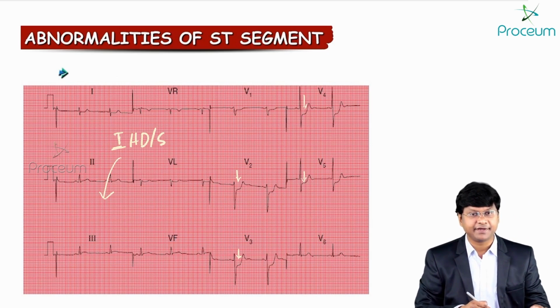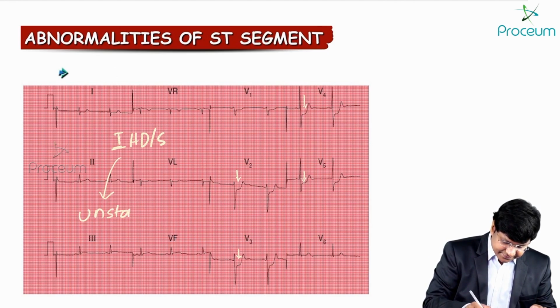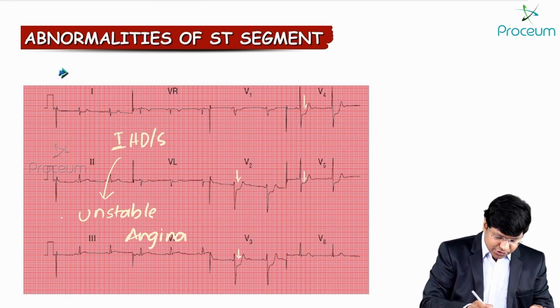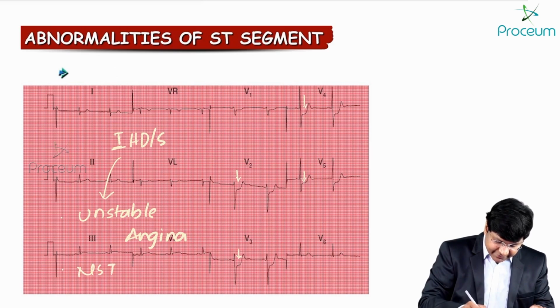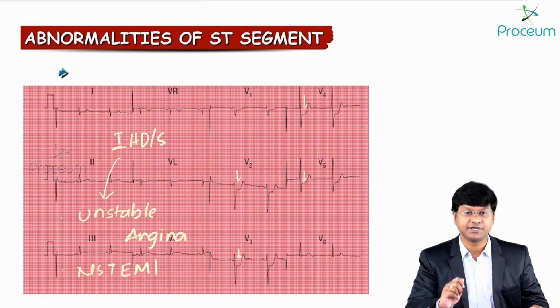Because the ST segment depression is there, I will consider either unstable angina, or I can also consider non-ST elevation MI.